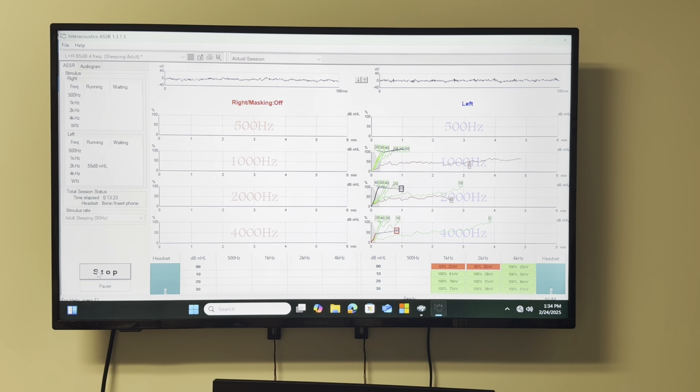How does that change if you were to change the protocol to awake? If you change it to 40 hertz, the repetition rate is going to be 40 hertz. 40 hertz thresholds are better, so that's another project. The amplitude will be larger. Historically people believe that 40 hertz is affected by sleep. A previous student did 40 hertz ASSR in sleep, and the thresholds were better than 90 hertz.